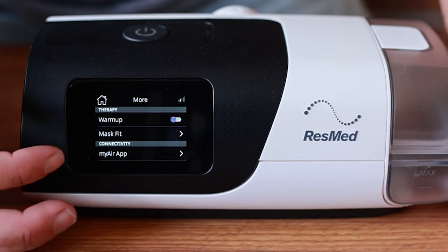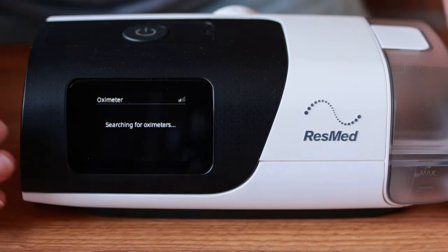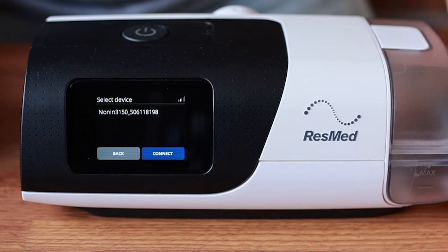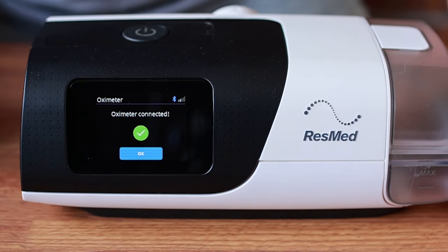Once you've got that on, you literally go to 'More' at the bottom, then it says 'Oximeter' — click Oximeter, click Search, and then Connect. Oximeter connected.